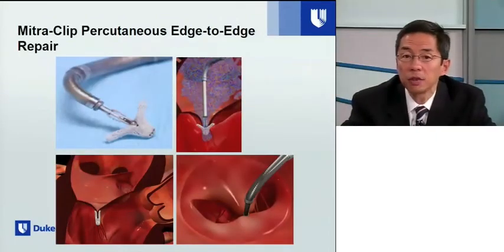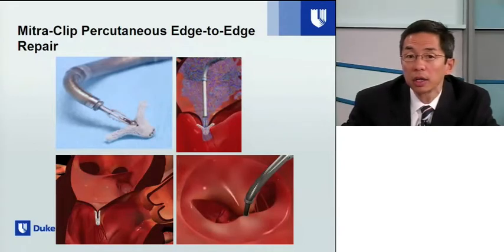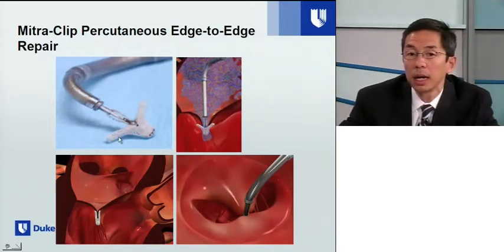This is a schematic of the E-valve MitraClip device, which is the percutaneous device for edge-to-edge repair. It is delivered on a catheter through a transeptal procedure. You can see in the first slide here, there are polyester-covered arms that go on the ventricular side of the mitral valve leaflets, one for the anterior leaflet, one for the posterior leaflet, and then there are grippers which lower on the atrial side to essentially capture the leaflets between the arm and the gripper. The polyester covering promotes endothelialization and ingrowth to cover this device.